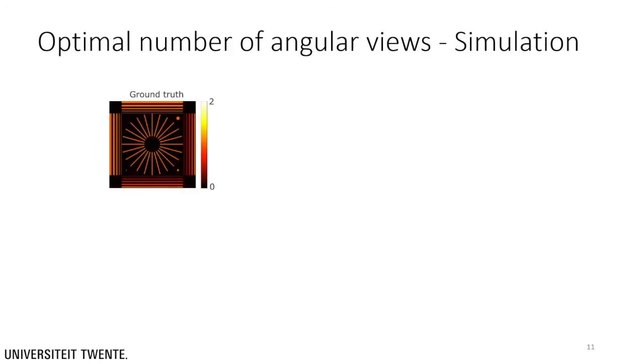To answer this question, we did a simulation study. We developed a numerical phantom with structures with different thicknesses, orientations, and absorption levels. We simulated forward acoustic wave propagation using the K-Wave toolbox and reconstructed the images using a Fourier domain algorithm.